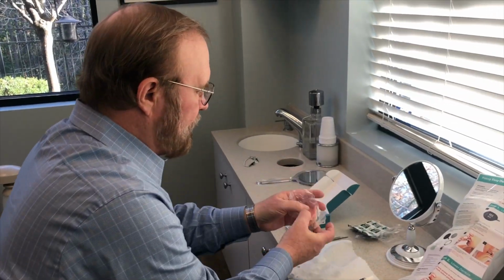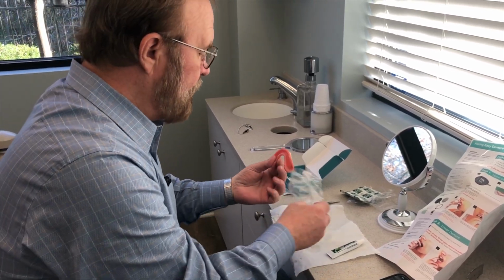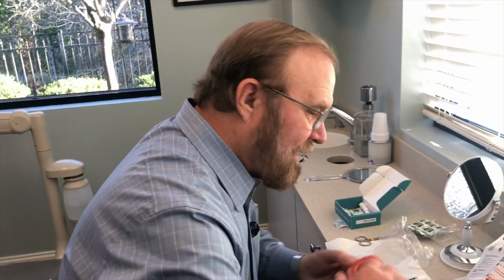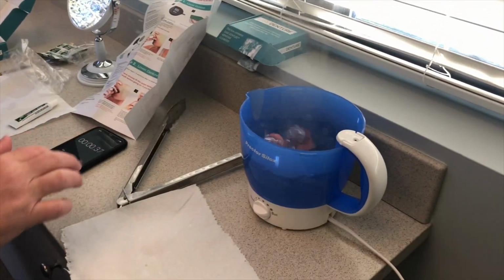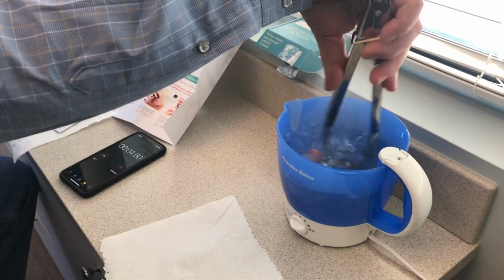I'll ask you the same question again. Overall, with that upper, you've got pretty good retention. Yeah, they fit great. It's kind of weird. You did mention that you have a sharp spot in the roof of the mouth there. We can adjust that with the acrylic burr afterward, or if you wanted to reheat that area, we could do it again.